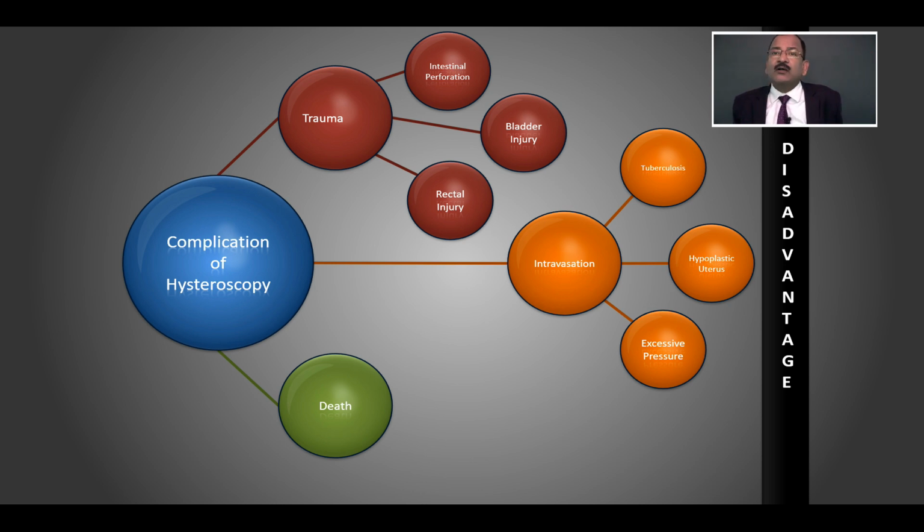So I will show you how they do. So this is bad. And sometimes what happens, fluid is finished and then air enters. So you must have a Y channel and carefully someone should watch the fluid, and if it is just about to finish, lock that channel and open the other channel, so that air will not go.